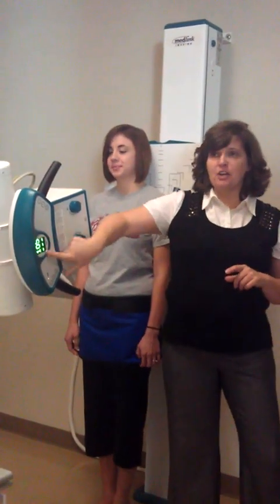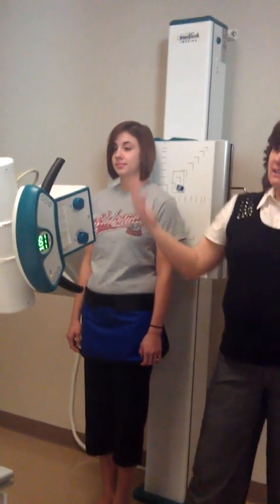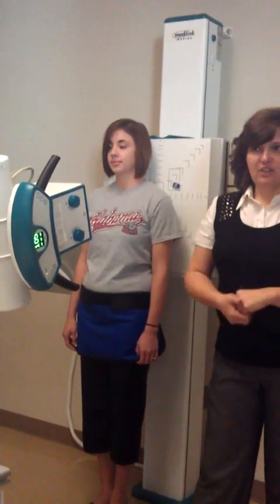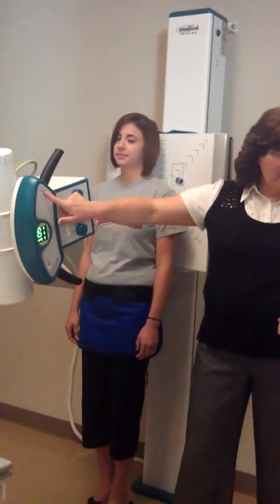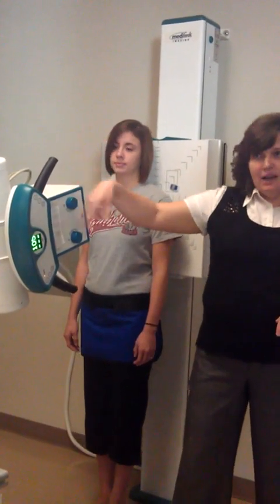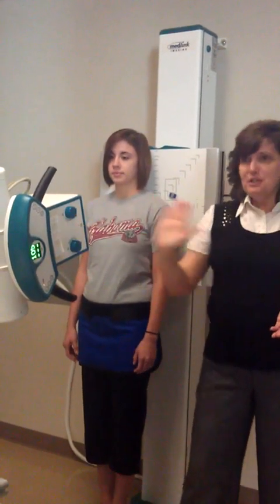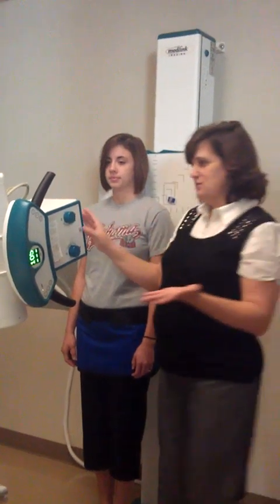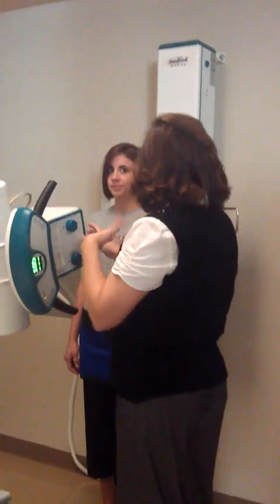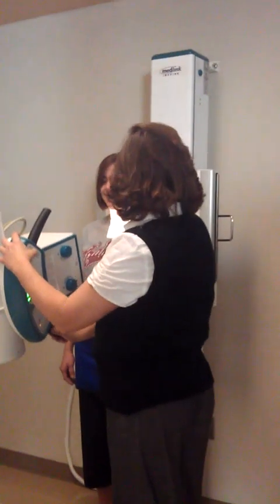We're at 105 and you can see our numbers disappear. Another thing — I was telling them this machine gets confused very easily. These are opposite: this up-and-down button is not up and down, it's this way, and this side-to-side button is now up and down. It just gets confused — that's fun, it's tricky. That's going to be awesome trying to do that.